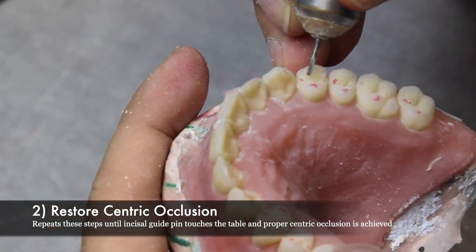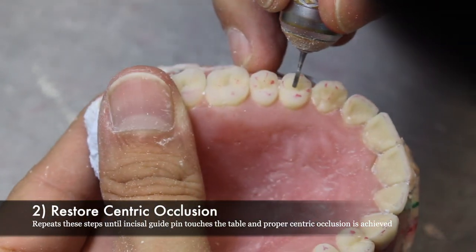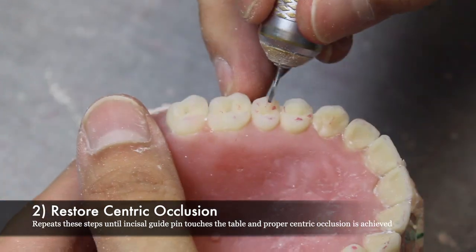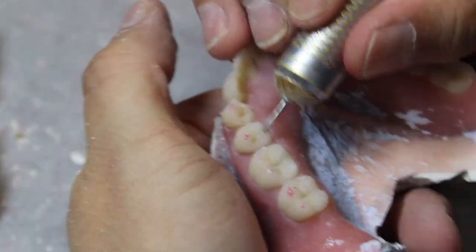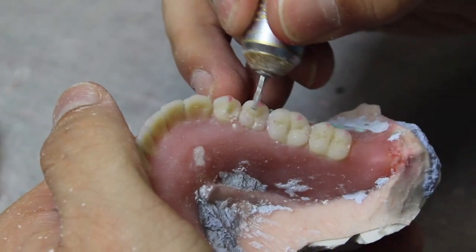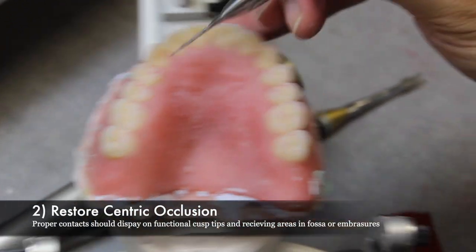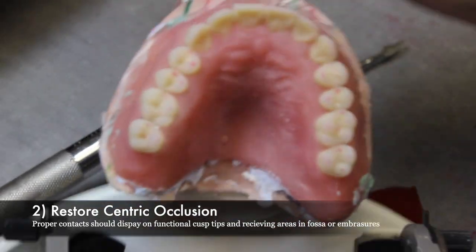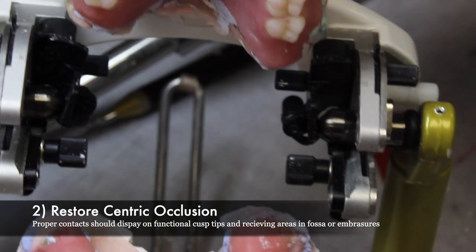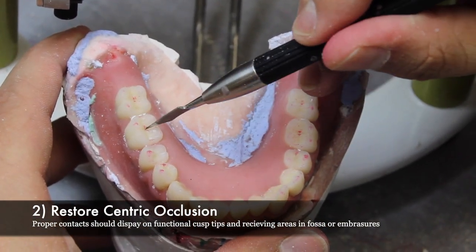It is important to note that although an incisal guide pin may touch the table, it does not mean the tooth-to-tooth relationship is accurate. And vice versa, just because teeth are touching properly, it does not mean the incisal guide pin is touching the table. Be sure that these two things coincide. The proper contact should display on functional cusp tips and receiving areas in fosses or embrasures. On the maxillary, the functional cusp tips are the lingual. On the mandibular, the functional cusp tips are the buccal.